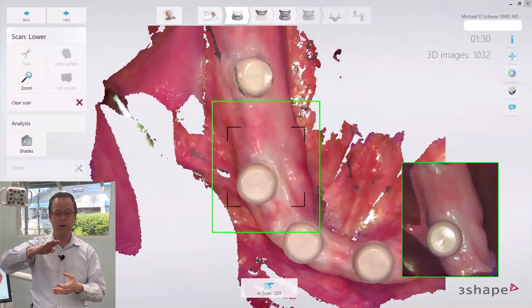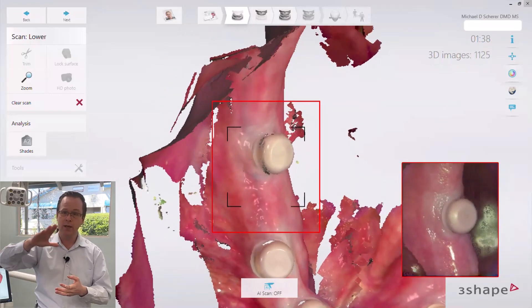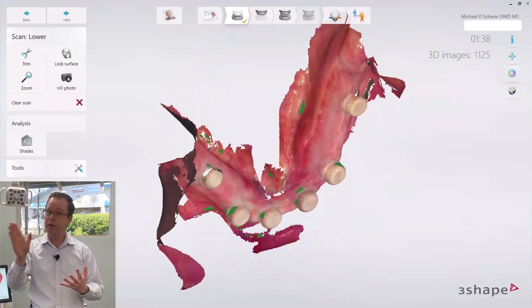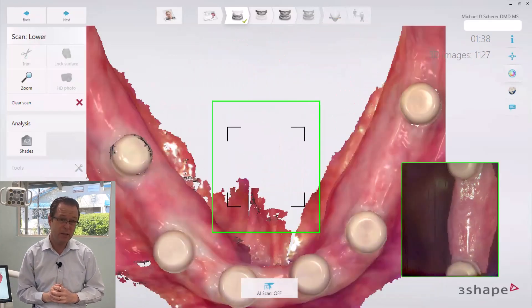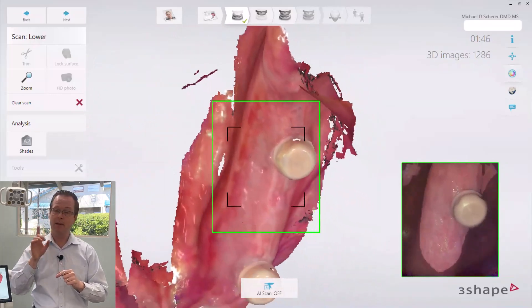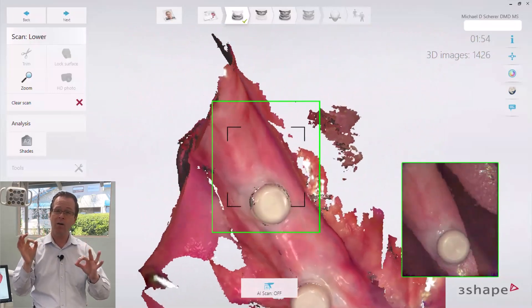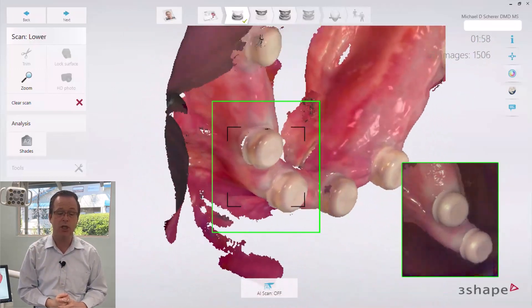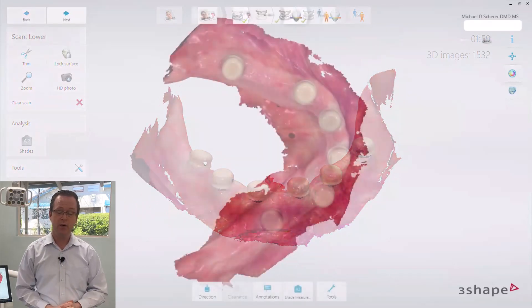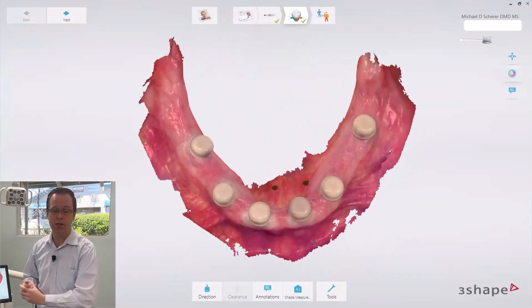As I swing back around, notice I'm bouncing out, bouncing down — trying not to pick up too much extra soft tissue. The locator bounce as I bounce in and out helps me streamline this edentulous scan. Moving the scanner around, I notice some extraneous soft tissues and want to pick up a little more detail of my locator scan body. Hold out, bounce in a little bit, move my scan around. All I want to do is image to pick up better details around the scan body geometry, being mindful not to pick up too much vestibular soft tissue. Just a little cutting away of that extraneous soft tissue and we've got a really nice scan completed on this patient.